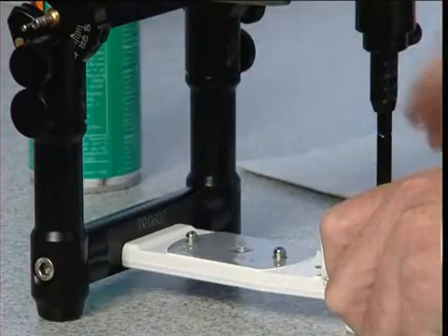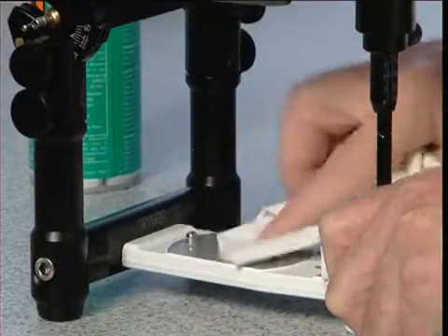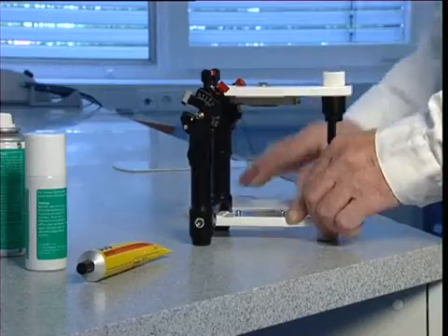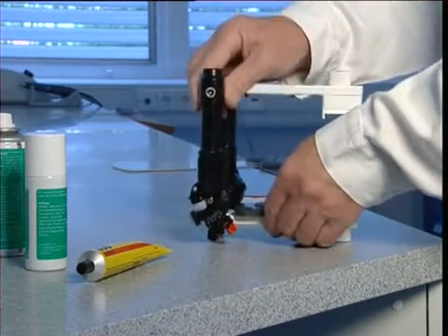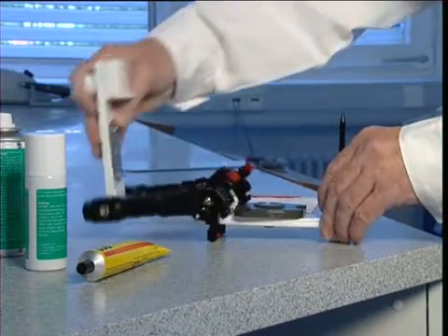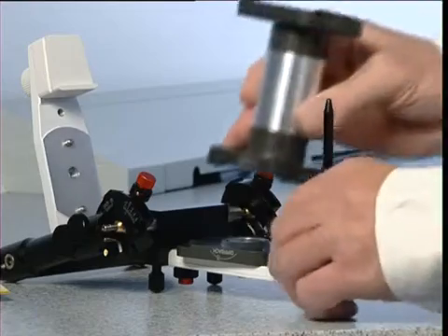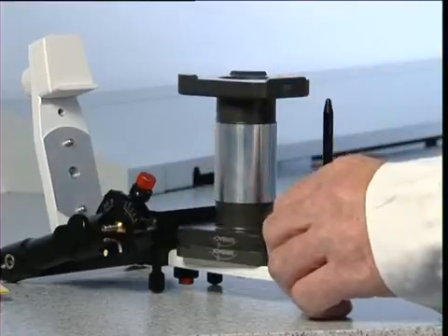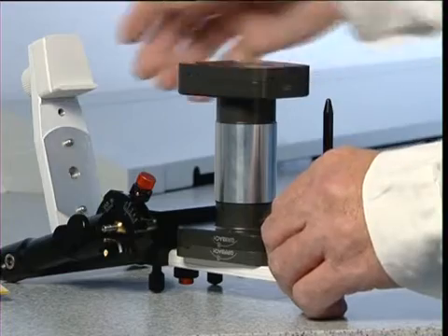The bare areas of the articulator and split-hex magnetic plates are degreased with a special cleaner and wiped dry. The upper plate is screwed into place and the split-hex plate placed on it, top to top. The lower plate is then placed on the jig. The centric lock of the articulator must be open.